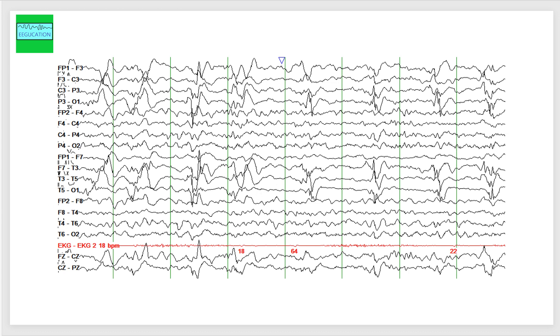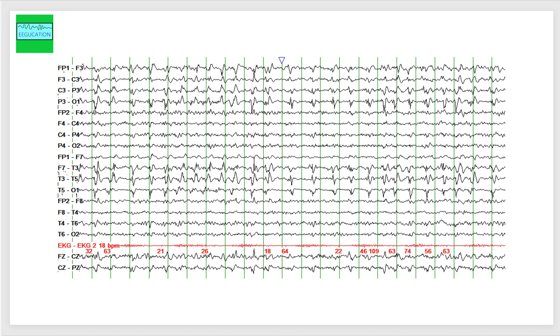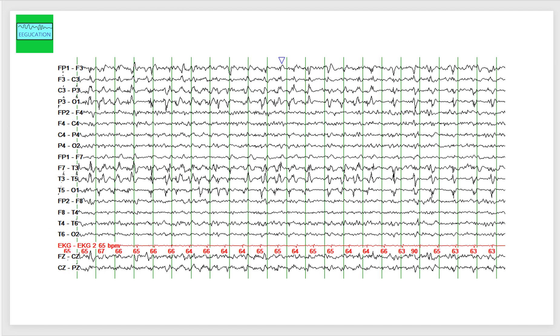In the next slide, what I've done is I've compressed the EEG, so you can see that there is no clear evolution in these sharp waves. This is the next slide here, which shows the asymmetry between the left and the right hemisphere.